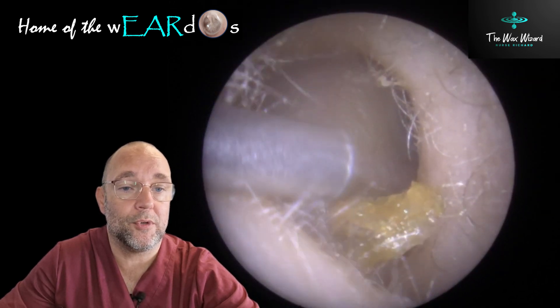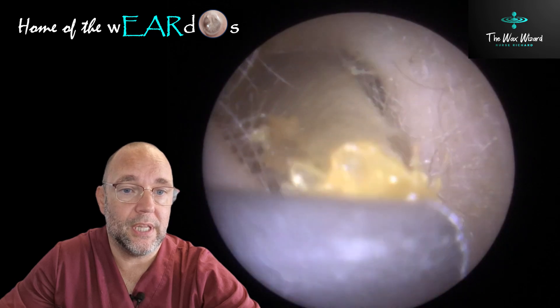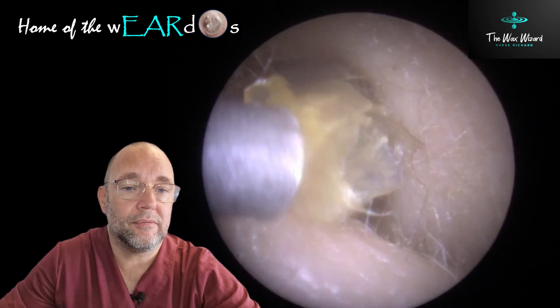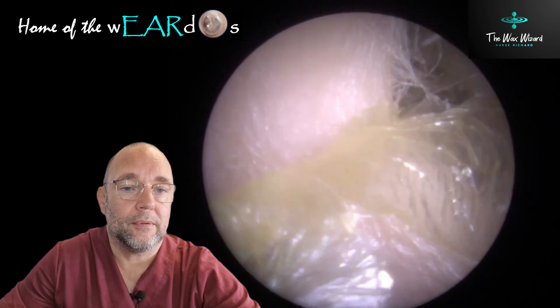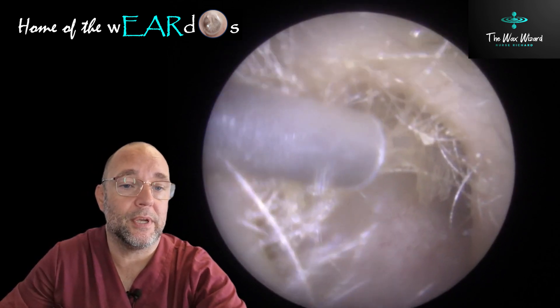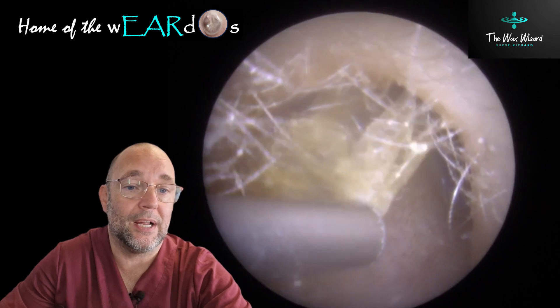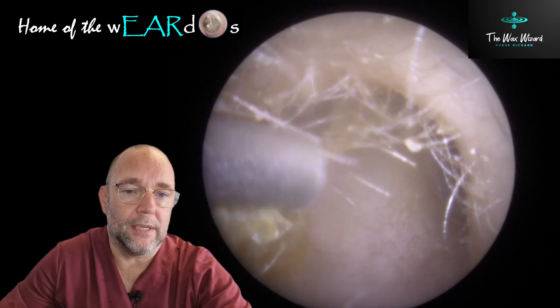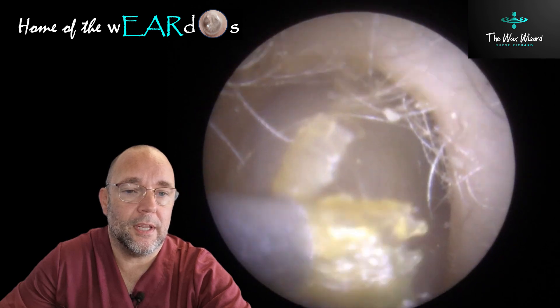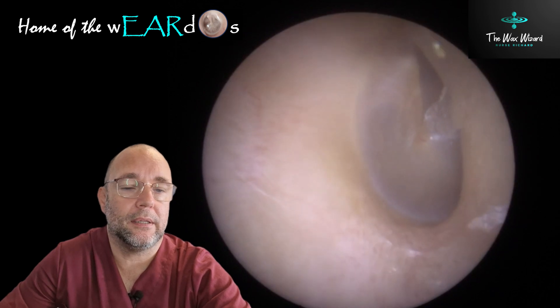This is the fining tube that I'm using here — that's the smaller of the two tubes. The reason I'm using that is because it's mostly dead skin in this removal, as you can see. You can see the little ripples of the skin on that one when it comes out — look at that really nice clear shot. It ripples as the ear is shedding itself, slowly moving sideways out of the ear. These are my favourite kind of skin peels because it comes away without you even needing to go in the ear that deep at all. That came away really nicely — beautiful, shiny, clear ear canal. Fresh as a daisy.